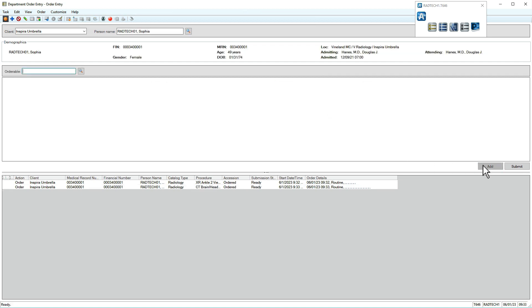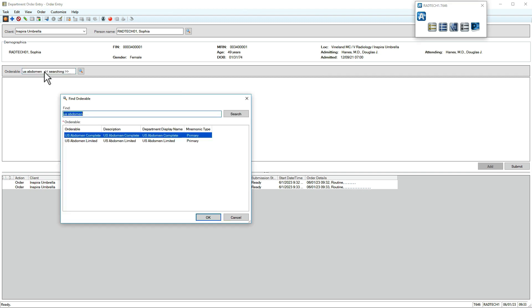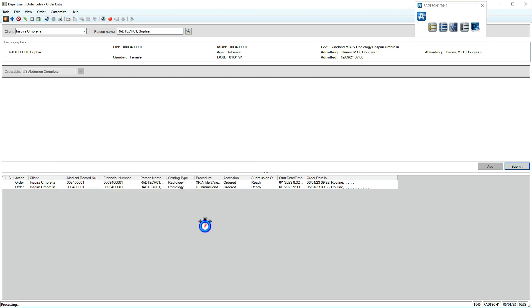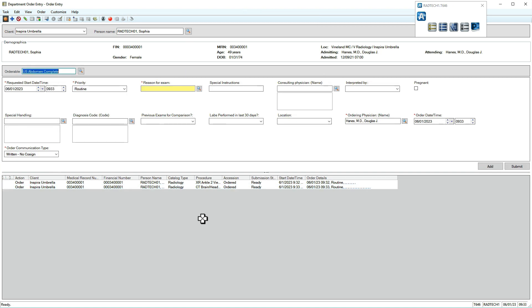We'll add another order. Note the requested start date and time. This dictates when the exam will appear in the online worklist, according to preferences you set in that application.